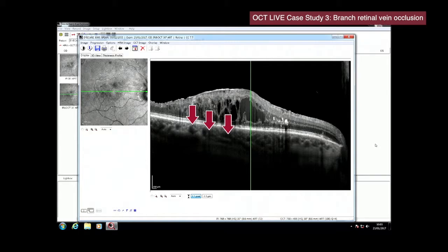Okay? The RPE appears to be intact, as do the outer retinal layers, although we're getting some shadowing here. This is again caused by the fluid voids within the OCT scan. A number of you I heard discussing this hyper-reflective material here. Again, where's that located? It's the level of the outer plexiform. And the outer plexiform and Henle's fiber layer effectively act as a middle limiting membrane. And what we're seeing here is lipid and lipoprotein exudate, which is very, very reflective, and we can also see it on the fundus reflectance image. And this is a sign that this is a long-standing change.